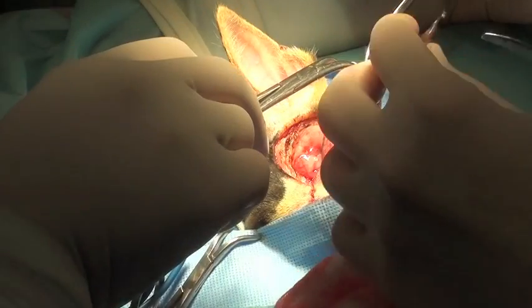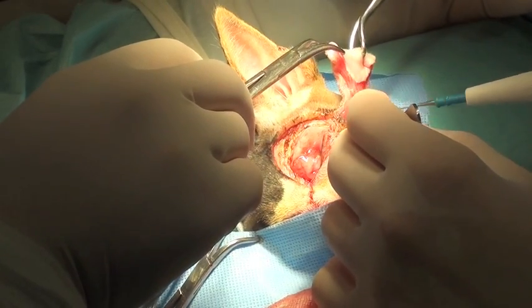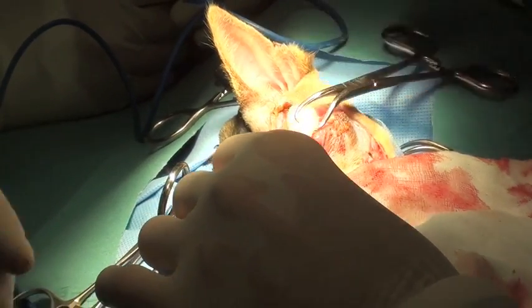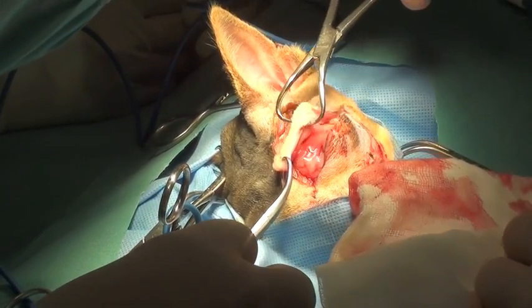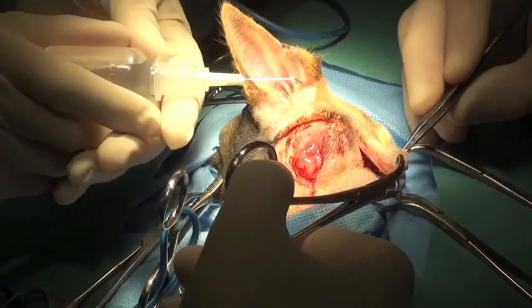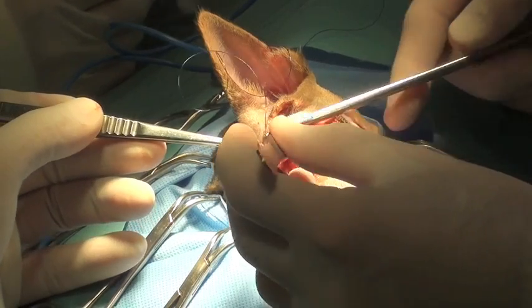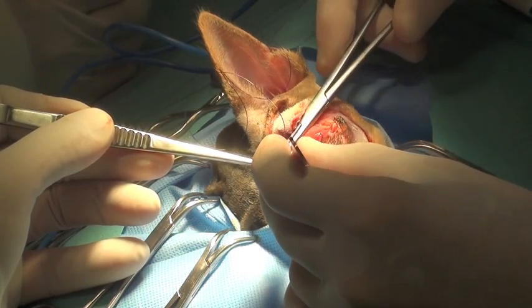A large proportion of the intraoral mucosa is preserved with the flap in order to allow reconstruction of the conjunctiva. The cornea is continually lubricated using buffered saline solution. I've got a 5-0 or an 8-0. I'll take some 5-0 PDS.